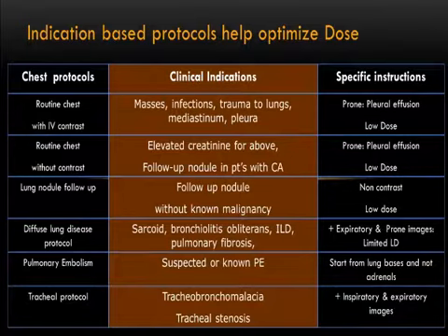And then, of course, you can have an airway or tracheal protocol, which should be clearly different from the diffuse lung disease protocol. The reason being, when you are talking about airways, like a tracheal protocol, you're looking for big structures, structures that are this big, or at least a couple of millimeters, and they have air surrounded by vessels or the wall. So very high contrast. So really you don't need the dose of diffuse lung disease to scan the trachea. It's a big structure, right? So at least have 3 protocols in the chest region: lung nodule protocol, a routine chest, and pulmonary embolism protocol. And if possible, you add the diffuse lung disease and tracheal protocol.